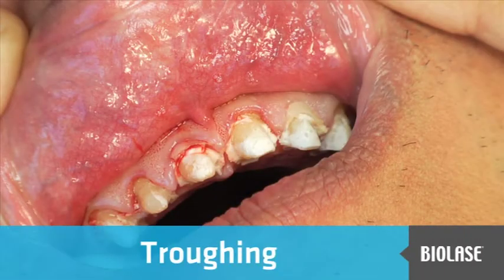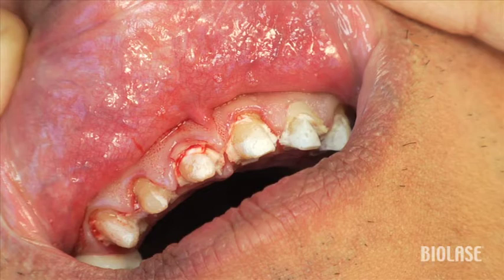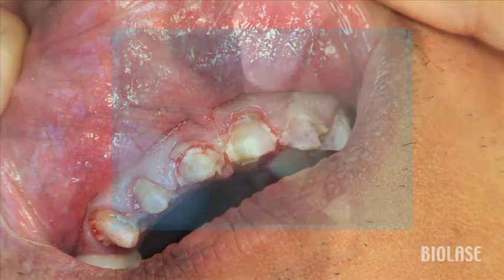This patient presented with a series of ill-fitting crown and bridge work which needed to be removed, re-prepped, and re-impressed. Considering the amount of inflammation in the gingival tissues, taking an adequate impression will be a challenge.